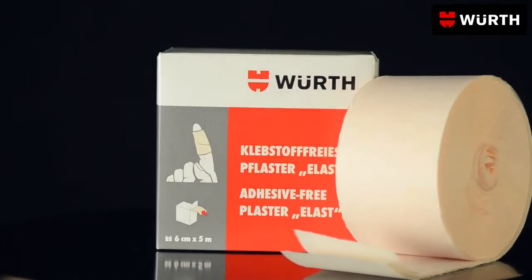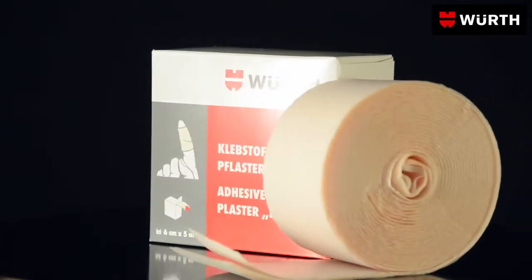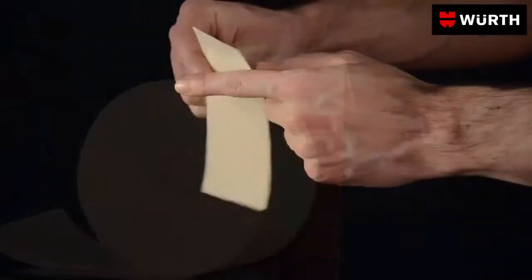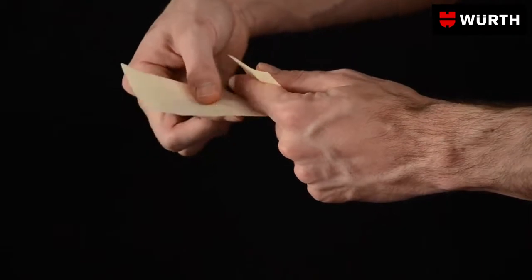Small cuts and wounds can be attended to quickly and effectively with WORS-ELAS non-adhesive plaster. The plaster is placed over the wound in a matter of seconds.